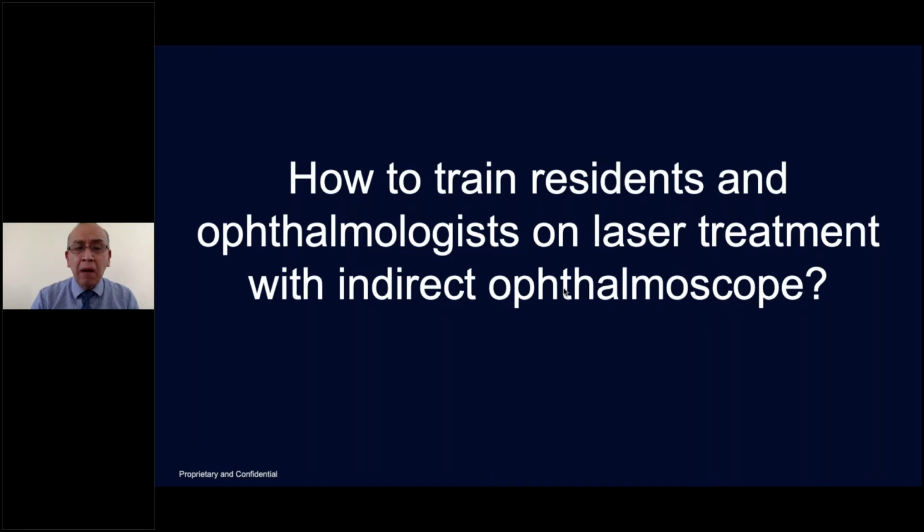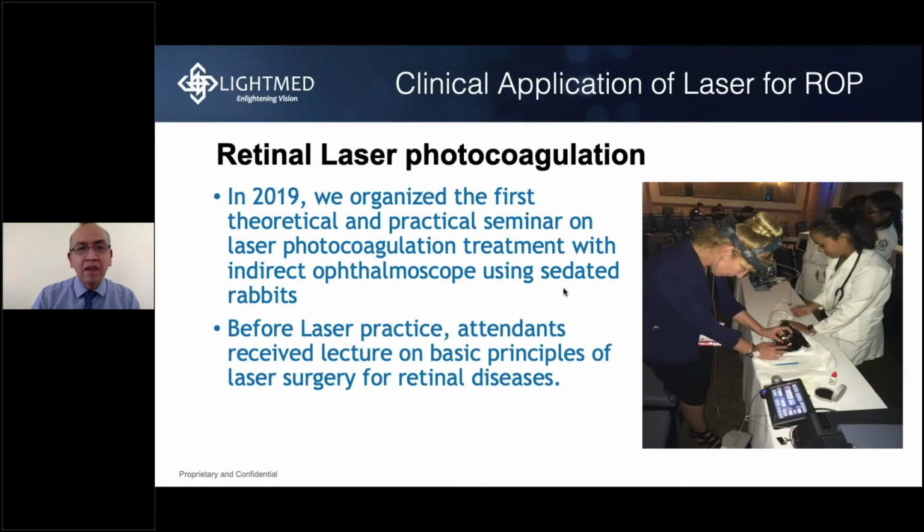Now I'm going to talk about how to train residents and ophthalmologists on laser treatment. I should say that it was Dr. Zepeda's initiative. In 2019, we organized, under the leadership of Dr. Consuelo Zepeda, our first theoretical and practical seminar on laser photocoagulation with indirect ophthalmoscope using sedated rabbits. It was very cool, and I will explain how we did it.